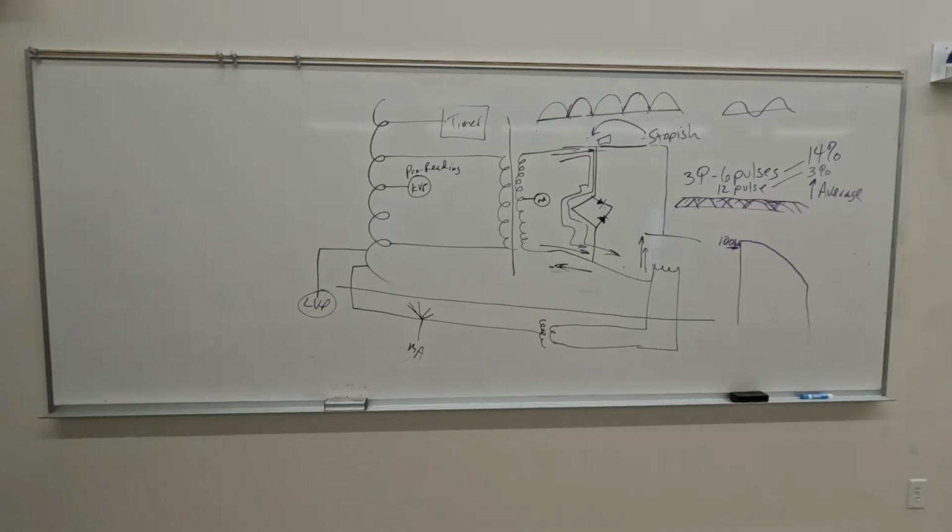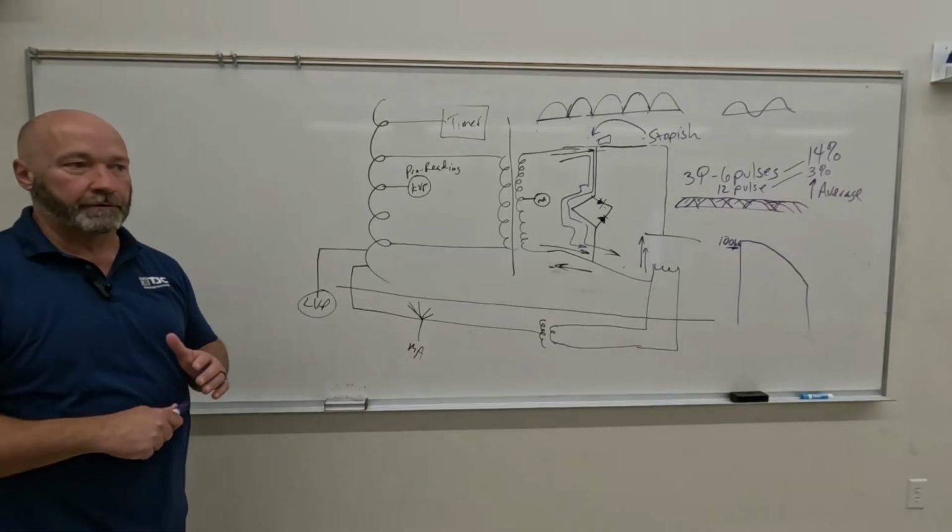So if you look on page 108, you'll see it. It says that power rating is the maximum tube current, that's your MA, possible at 100 kVp and 100 milliseconds. So they're going to be measured in kilowatts, not just watts. Maximum tube current at 100 kVp, 100 milliseconds, that's the power rating of your unit.